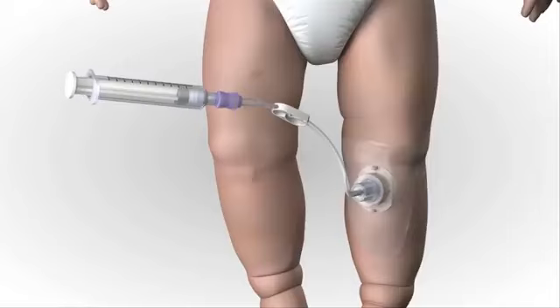Aspirate for blood bone marrow. Inability to withdraw aspirate blood from the catheter hub does not mean the insertion was unsuccessful. Consider attempting to aspirate after the flush. Site placement can also be confirmed by ability to administer pressurized fluids and noting the pharmacologic effects of medication administration after flow is established. Flush the catheter with 2 to 5 milliliters of normal saline.